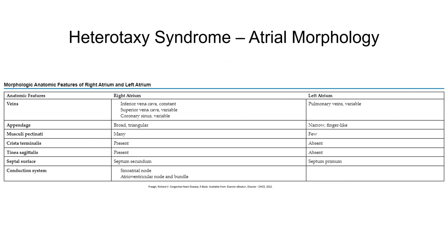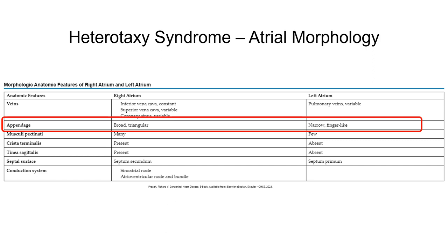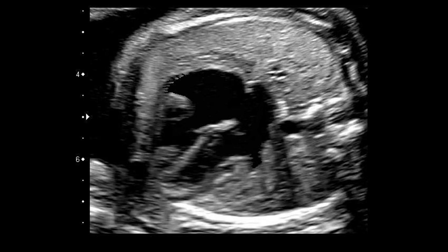Another feature used to discern between heterotaxy subtypes — right atrial isomerism versus left atrial isomerism — is the atrial appendages. On this four-chamber view you can clearly see the atrial appendages: there is a broad triangular-shaped right atrial appendage on the right atrium and a narrow finger-like appendage for the left atrium. These features will be seen bilaterally in either left or right atrial isomerism, and are a good indicator of the heterotaxy subtype in combination with other findings.